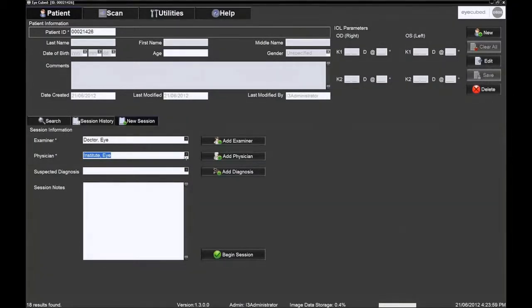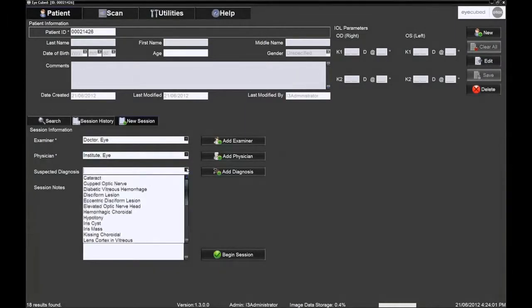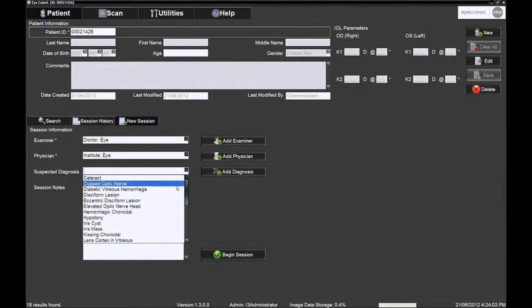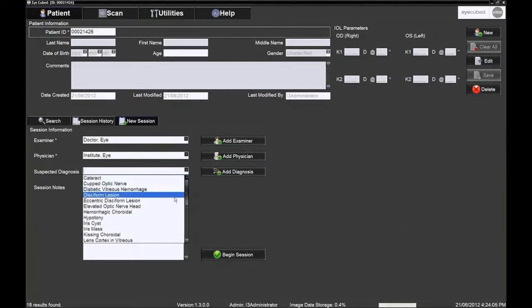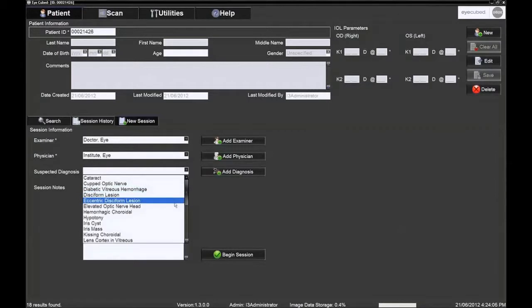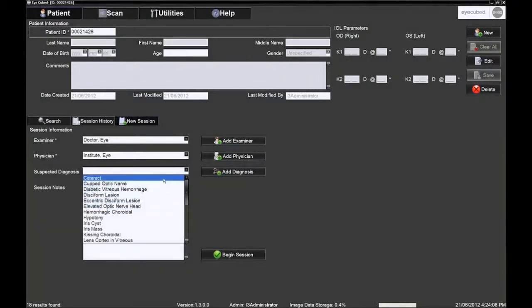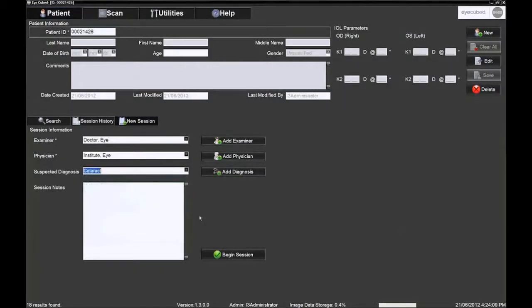At this point, it is possible to add a suspected diagnosis that will be saved in the patient's file. Click begin session to start the examination.